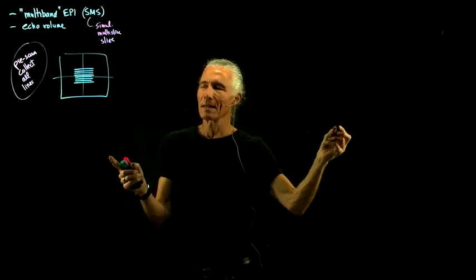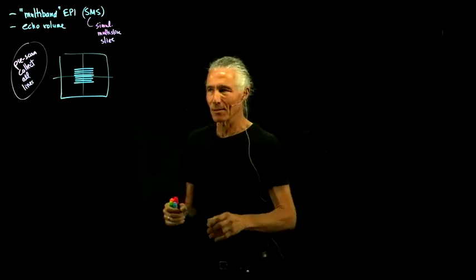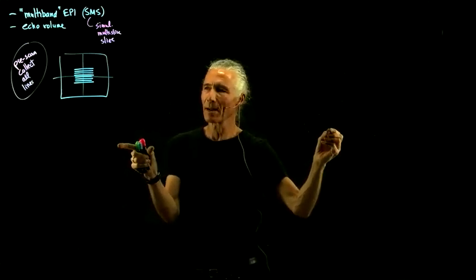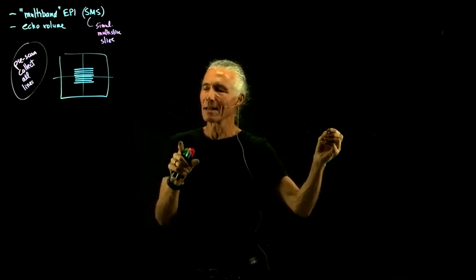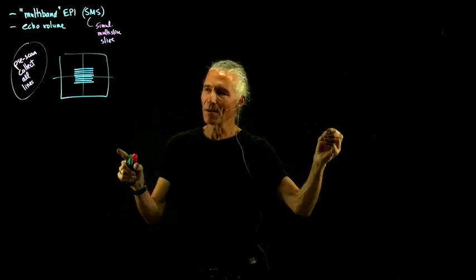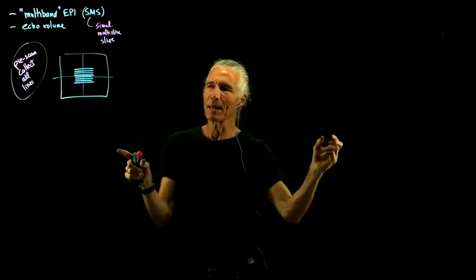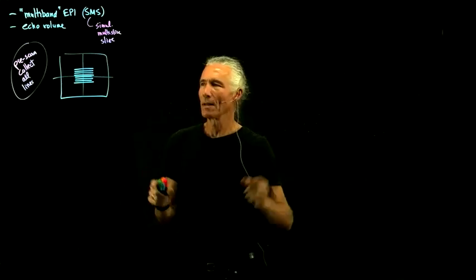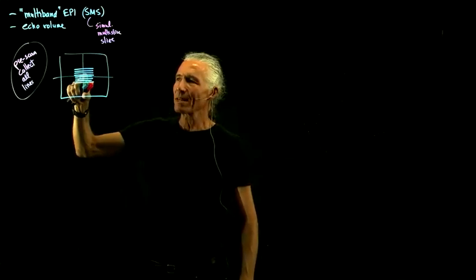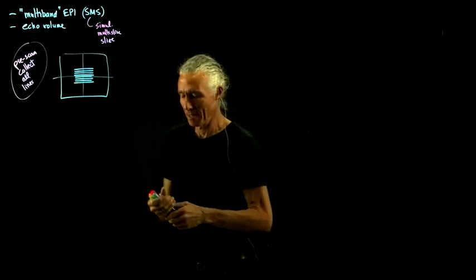And that argument applies to all spatial frequencies. So the amount of blurring of each spatial frequency caused by a coil that has a hotspot in it, like a Gaussian fall off, will cause every single spatial frequency in k-space to be equally blurred. And so that's why we just try to calculate the blur with the center of k-space where the signal is really good.